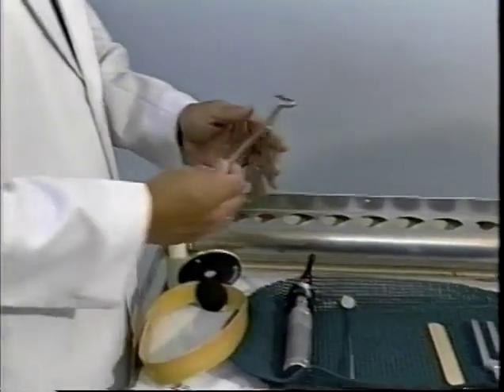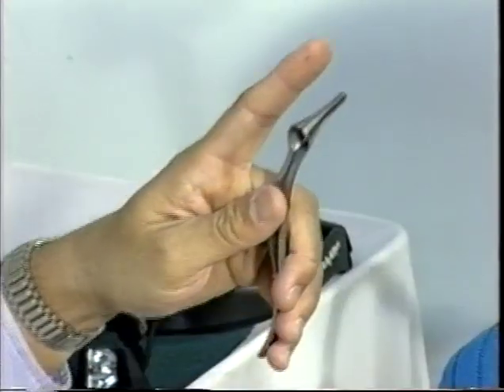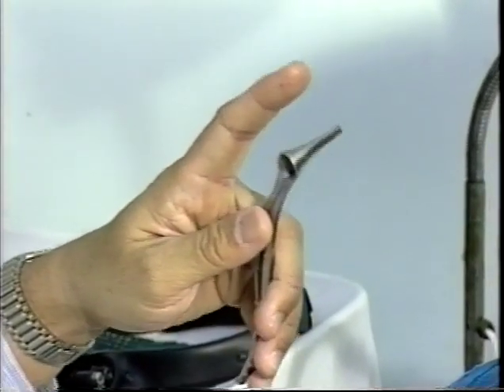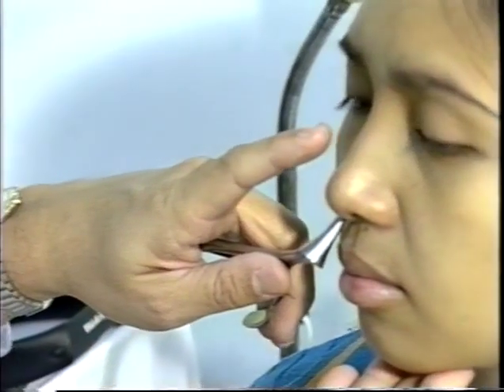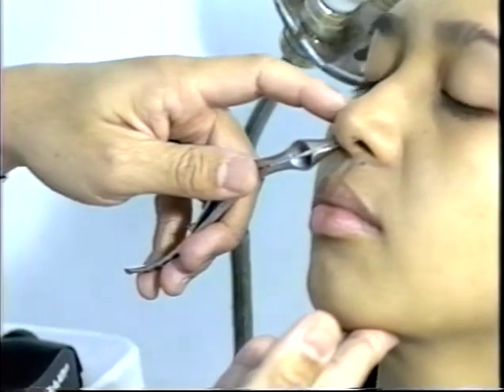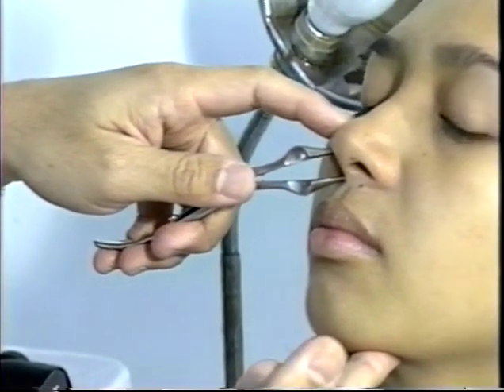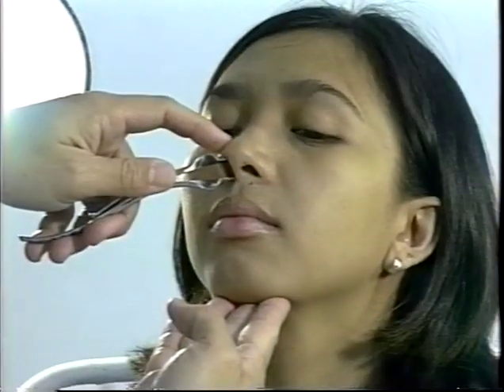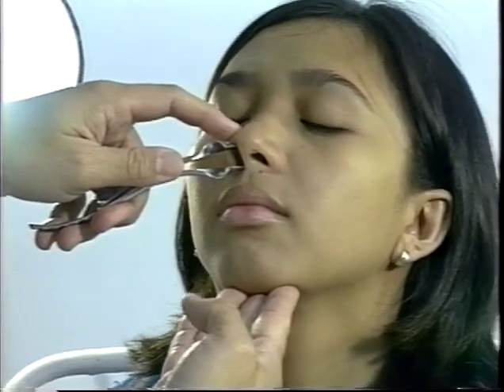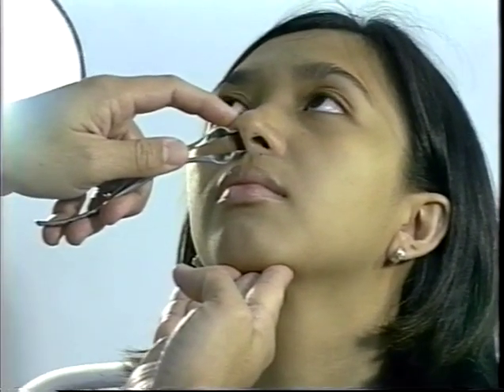Examination of the nose requires the use of a nasal speculum. Hold it with the thumb on the joint, the index finger free to steady it on the patient's nose, and the rest of the fingers on the stem proper to hold the speculum. Insert the speculum about one centimeter from the vestibule closed, and remove it slightly opened so as not to pull out any vibrissae.